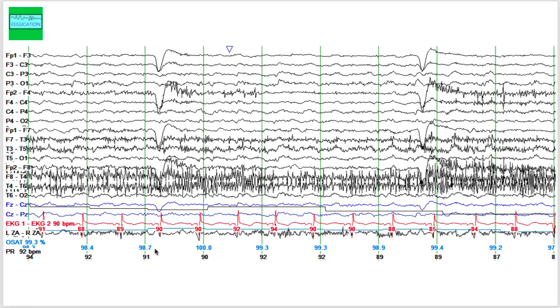Is the patient awake or asleep on this page? If you said the patient is awake, you're right. You again see the eye blink artifacts, you see muscle artifact, and you see a lot of muscle artifact at other times as well. So here you're seeing eye blink artifact and muscle artifact — the patient is awake at this time.